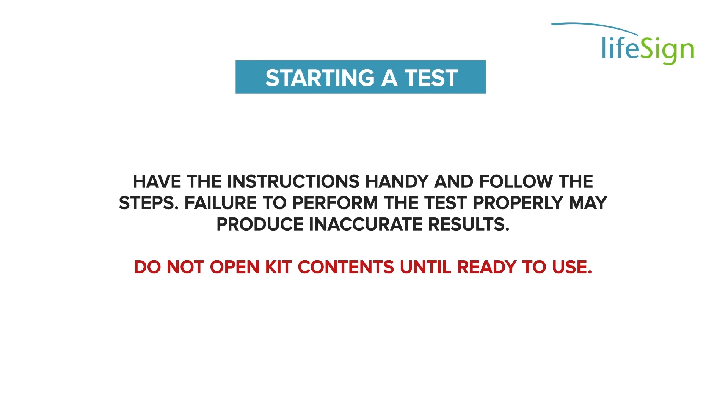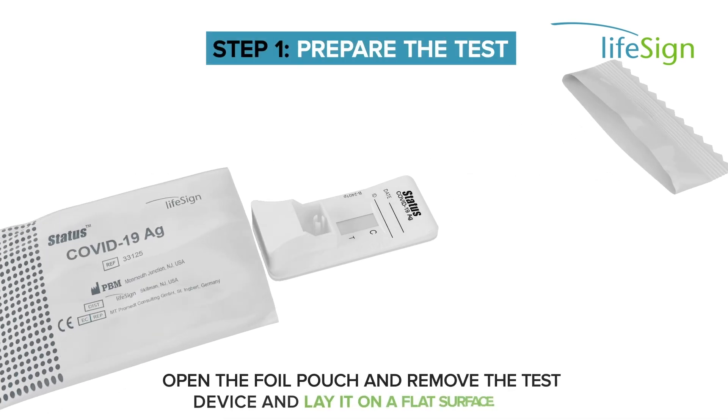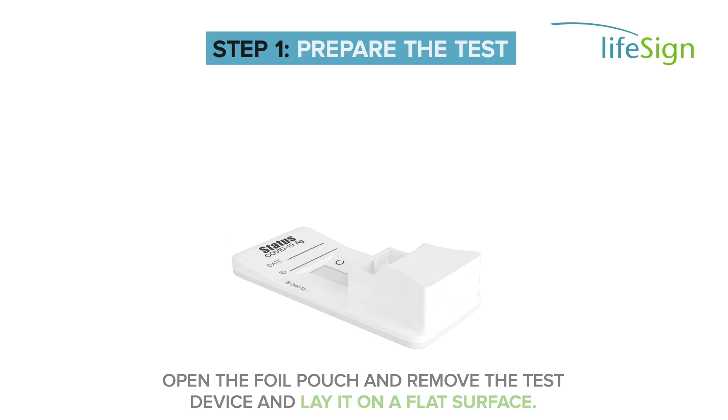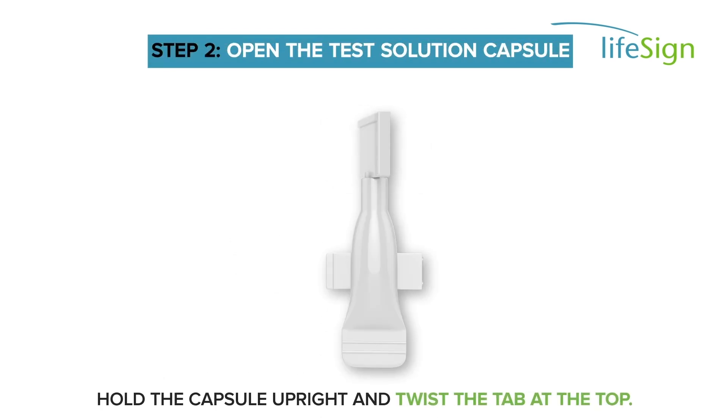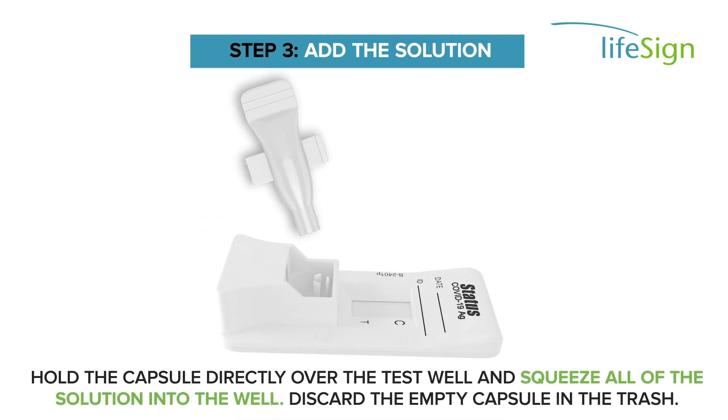Do not open kit contents until ready to use. Open the foil pouch and remove the test device and lay it on a flat surface. Hold the capsule upright and twist the tab at the top. Hold the capsule directly over the test well and squeeze all of the solution into the well. Discard the empty capsule in the trash.